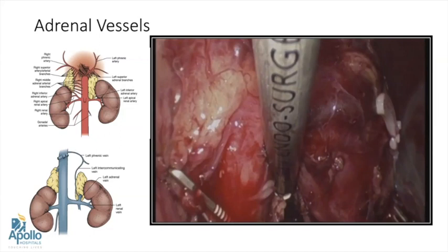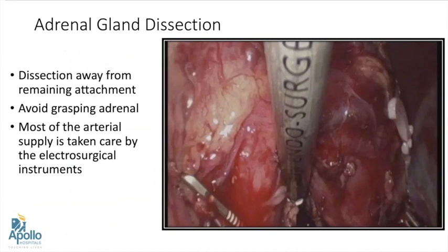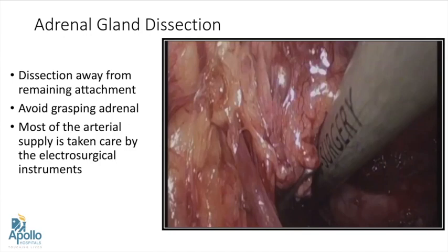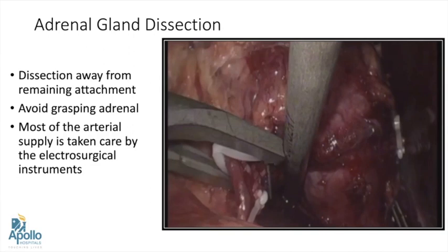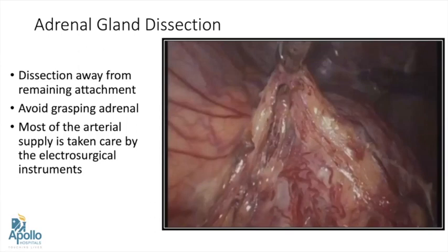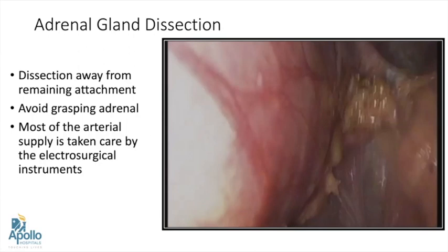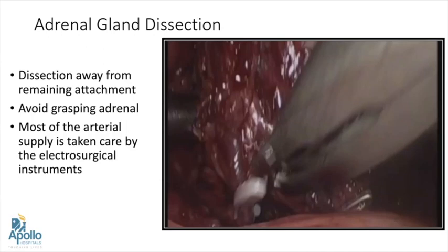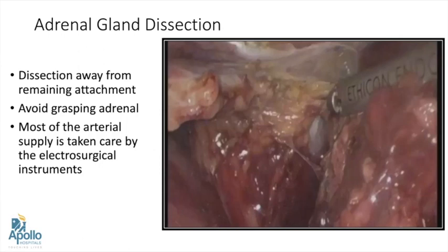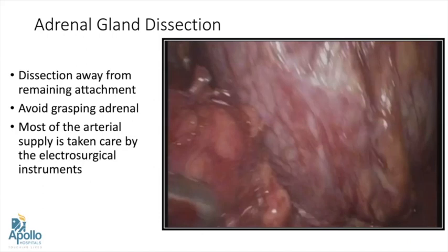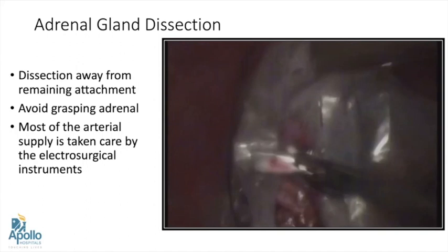Once that is done, the last part of the adrenal surgery is adrenal gland dissection. The gland is dissected away from all its attachments. Any vessels present are either clipped or managed with harmonic. We should always avoid grasping the adrenal gland because many adrenal tumors — especially myelolipomas — are very friable and there is a risk of entering the gland. Most of the arterial supply can be taken care of by the electrosurgical instrument. The lateral attachments of the gland can be removed and the gland freed all around. Most of the time you don't need any drain in adrenal surgery. There is no bleeding and the specimen can be bagged and removed.